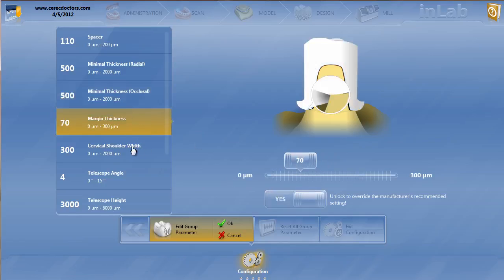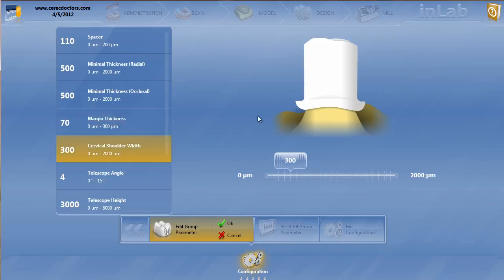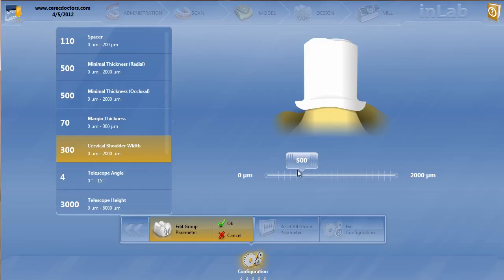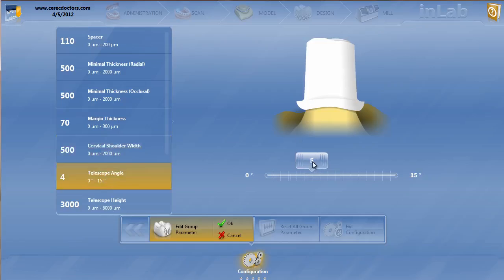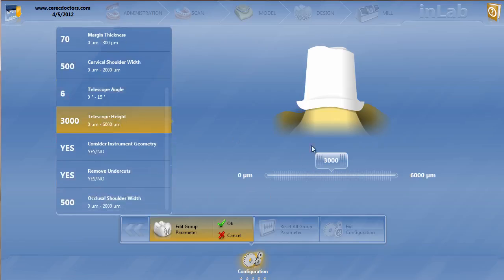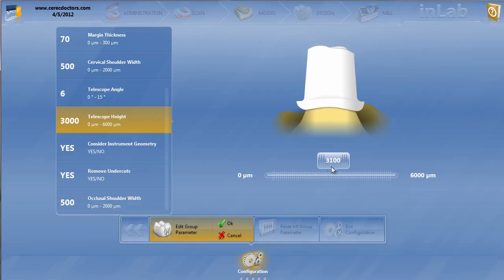We've got a couple other ones here. Cervical shoulder width, you can see down here. If we raise this, if we want to increase the actual platform, almost like a custom abutment in a way, we can actually do that. The telescope angle, depending on how many telescopes you have, you might want to give a little bit of divergence to it so it's not quite so parallel. If they're really parallel, you might have some difficulty seating the restoration. And then you can also control the telescope height very easily, depending on the height of whatever you're making that telescope on.